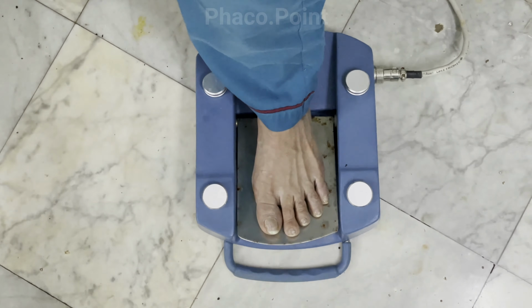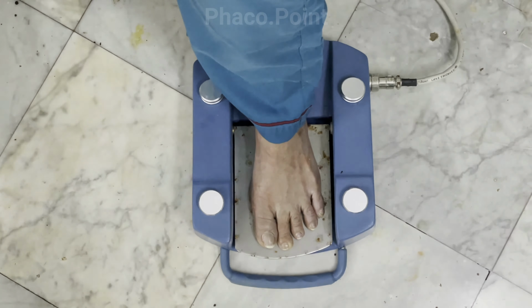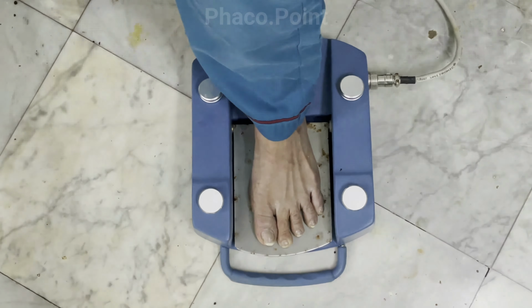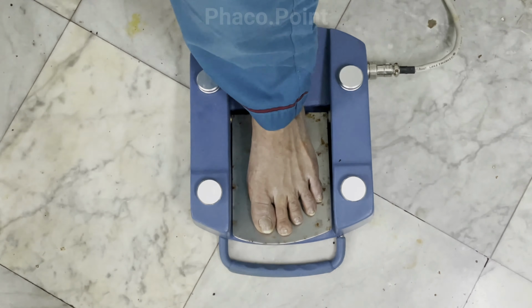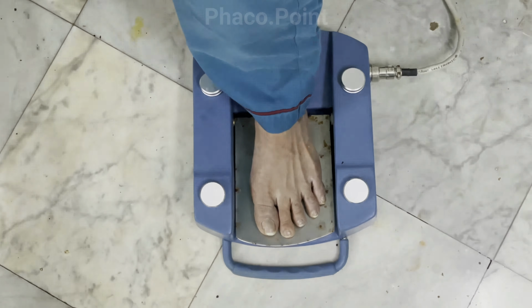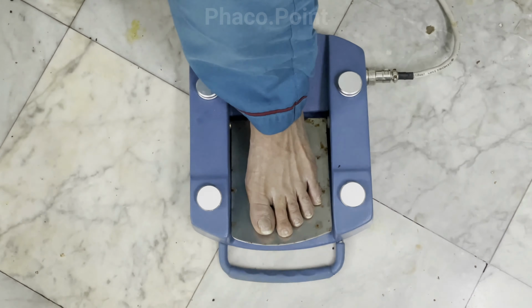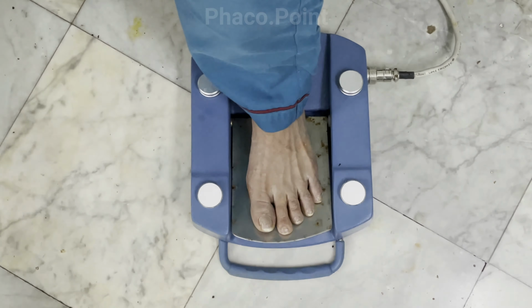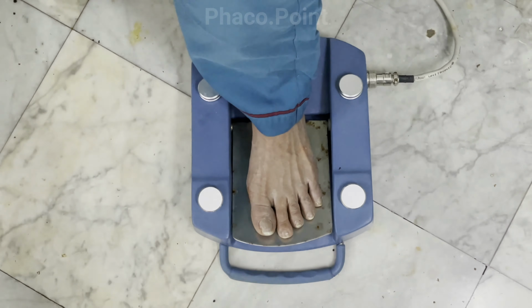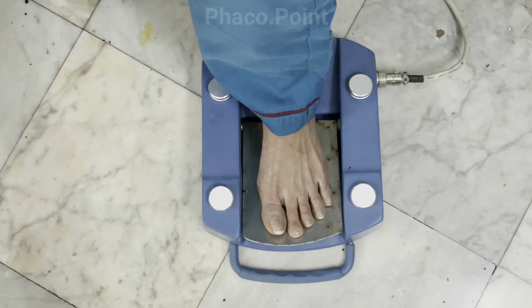So, the foot pedal now moves to 2 and then 3. Only when you get to foot pedal 3, you bury into the fragment, just enough to get a hold. Once you've got the hold, move back to foot pedal 2, bring the fragment up in foot pedal 2, go back to foot pedal 3 and emulsify the fragment, and as soon as the fragment leaves the tip, foot pedal moves to 1. So it is 3 to bury, 2 to hold, 2 to bring up, back to 3 to emulsify, and 1. So for fragment removal, it is 3, 2, 3, 1.